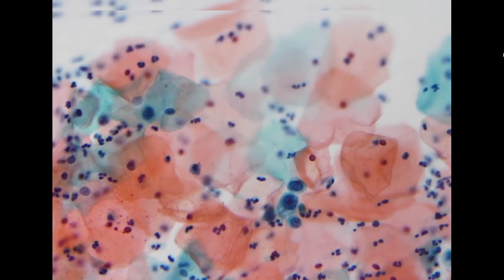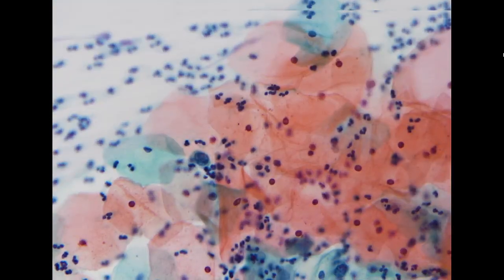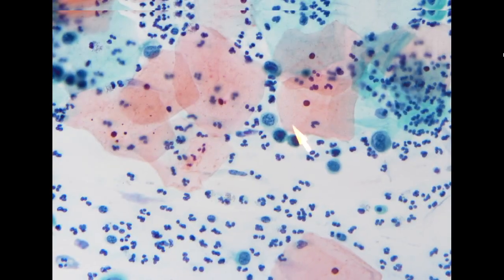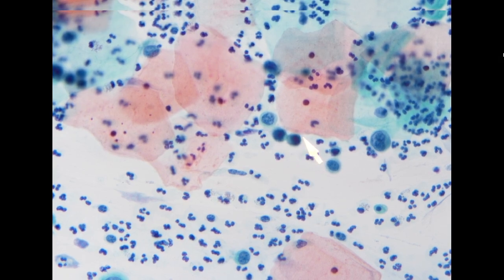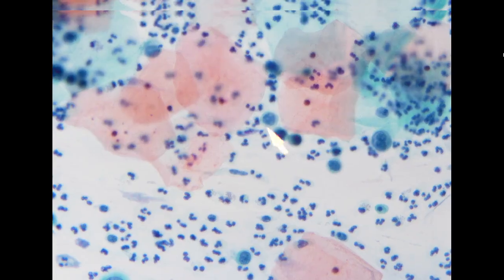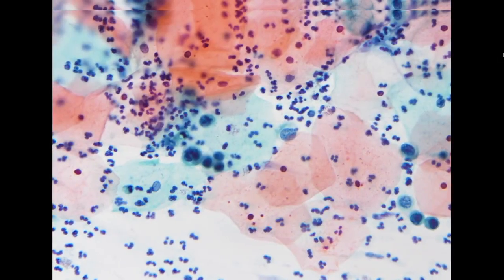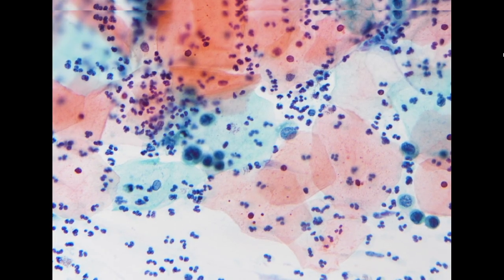So here is another one. And here is another one. So the features here, there are a few more. The feature of this cell shows a little bit of a degenerative pattern, but it is just too dark, and a little bit difficult to determine whether this is coming from the endometrium. If it is coming from the endometrium, usually we will have more of an endometrial debris type of background, but we do not see that here.